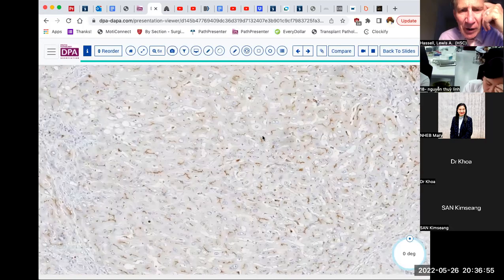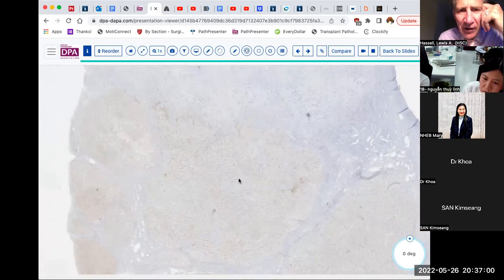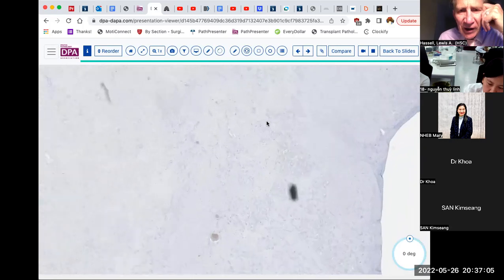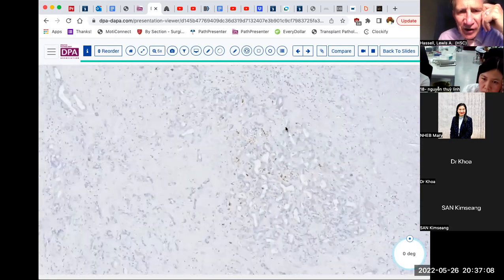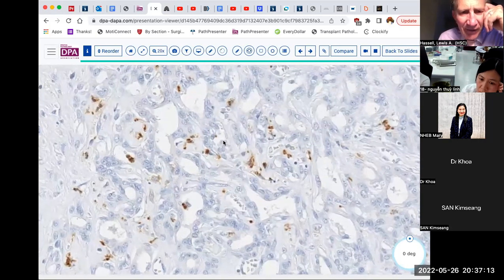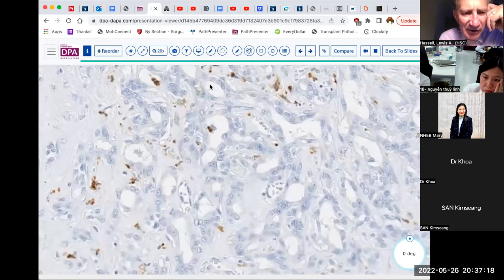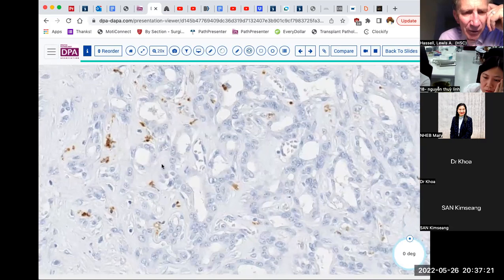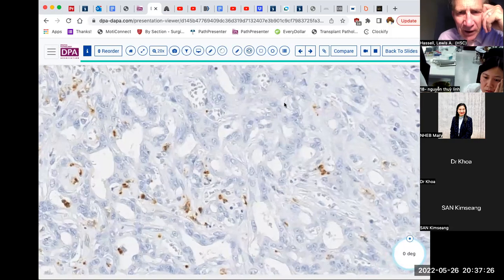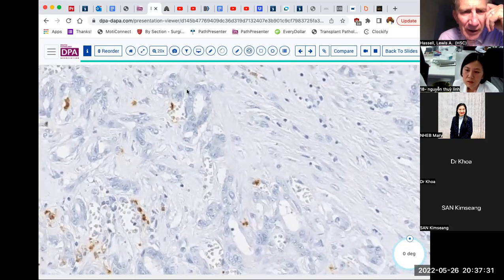And so again, it can be a marker for hepatocytic differentiation, but as I indicated before, the small ductular proliferation in cholangiolar proliferation is also looking for those little canaliculi. And so here we're also seeing some degree of positive staining, not in quite the same pattern, but a little bit. I don't think this is just non-specific staining. It's not staining every cell, but it's staining some of the cells.